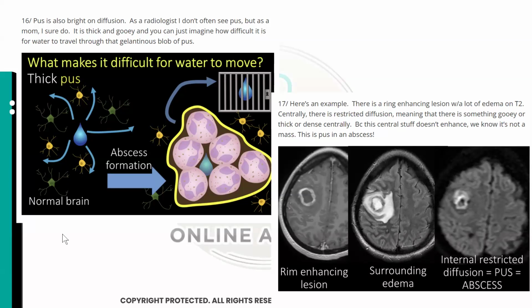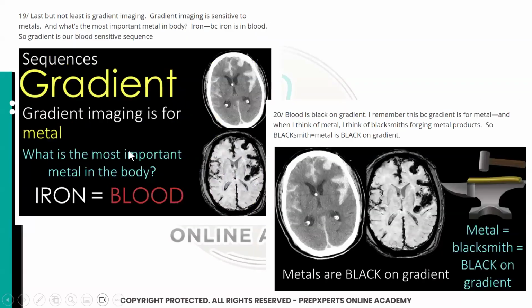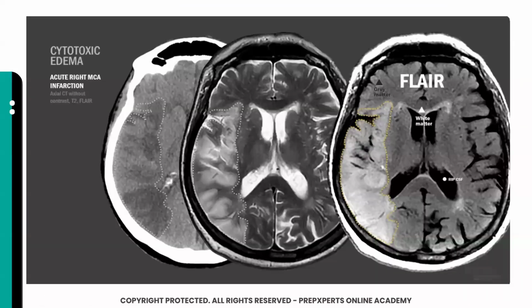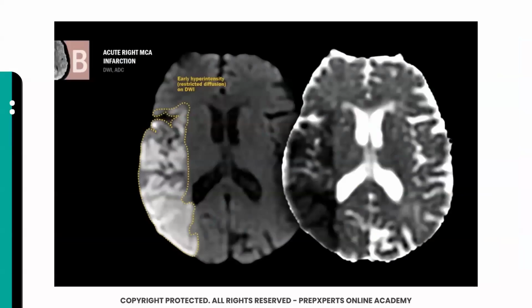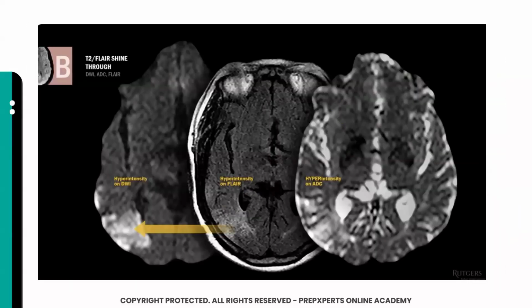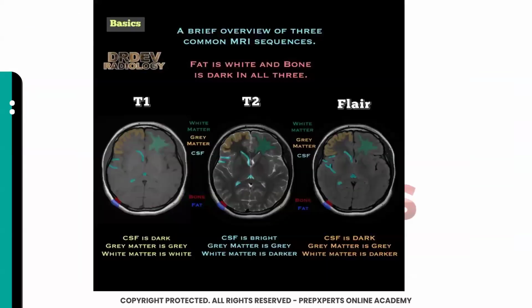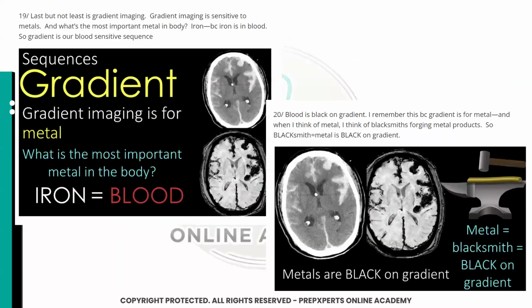So this was our fourth thing that can show restricted diffusion. Coming up next is our next symptom. So we are done with restricted diffusion. Lastly, what we do is our gradient imaging. Okay. We will learn about ADC as well in the next slides.